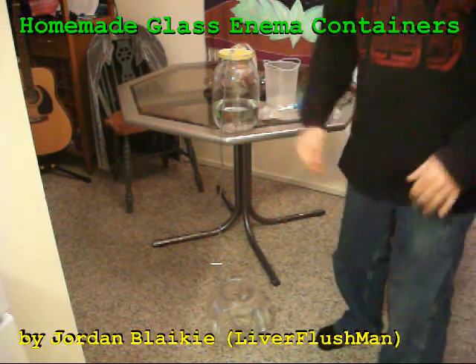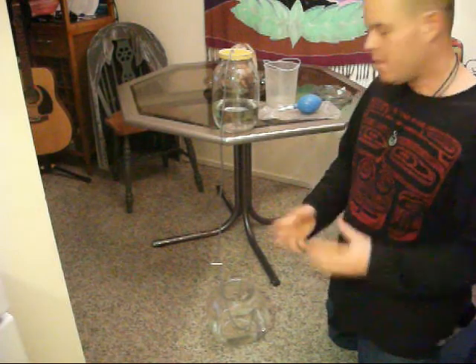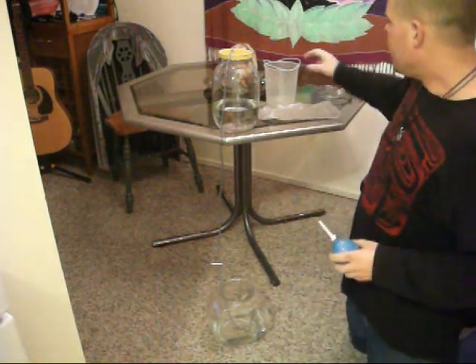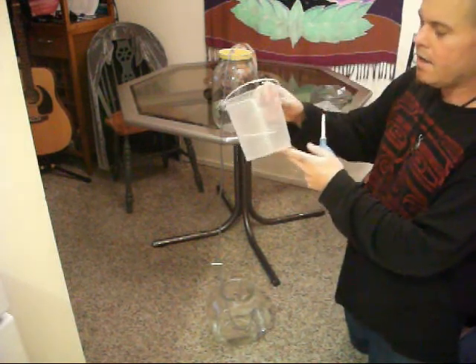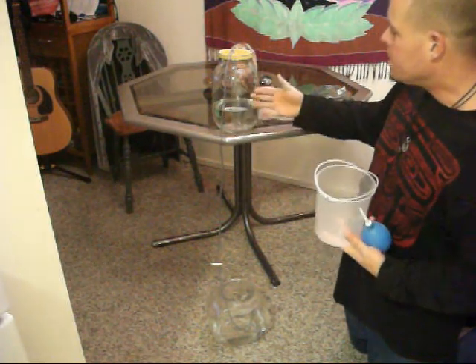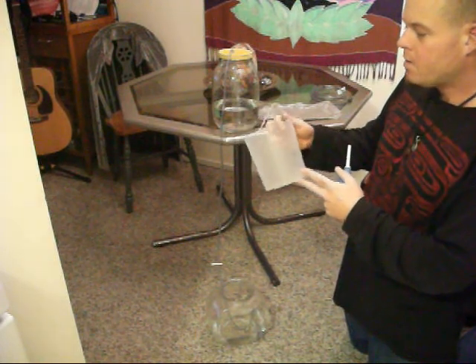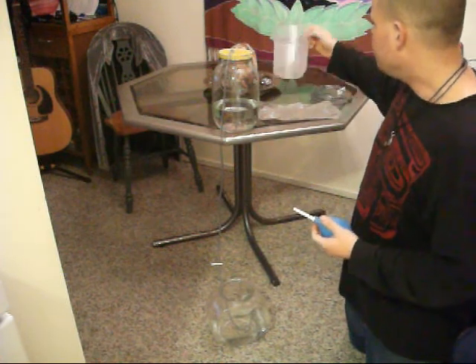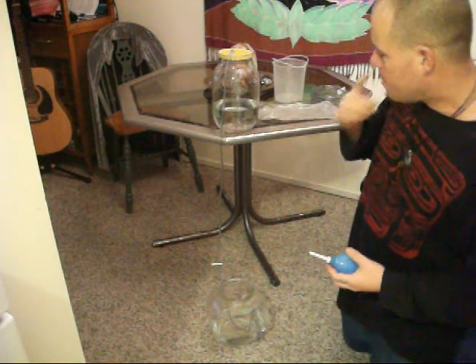For you enema lovers out there, you're going to be amazed at the homemade enema kit here. We have quite a few different options for you. The main thing is that the enema buckets that you buy are always made out of plastic, and glass can break and it's hard to ship, but ultimately glass is a better product because plastic can be toxic. It can have different things in it. It's ideal for traveling, but ultimately for your home, there's a couple of options here.